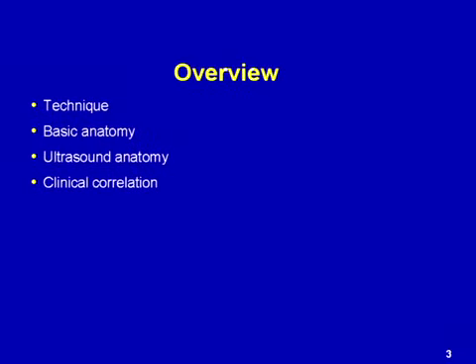In this portion of the DVD series, I will review with you the ultrasound evaluation of the shoulder. I will describe the basic technique for positioning of the patient. I will review some basic anatomy and then demonstrate the ultrasound anatomy. Finally, I will also review some clinical correlations.